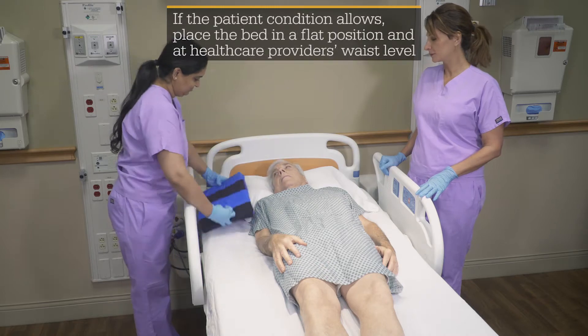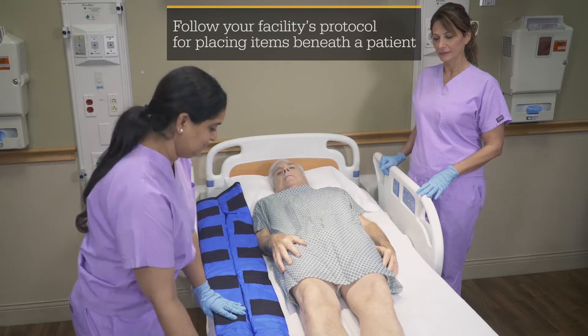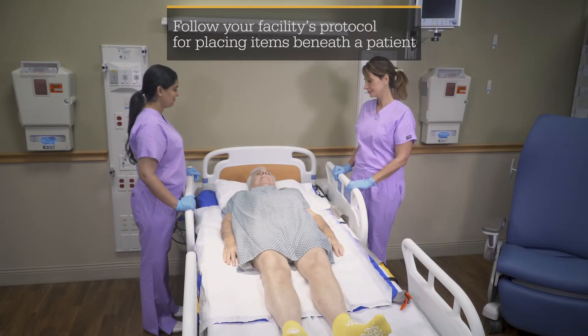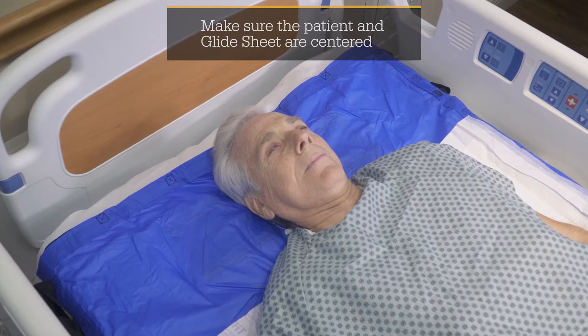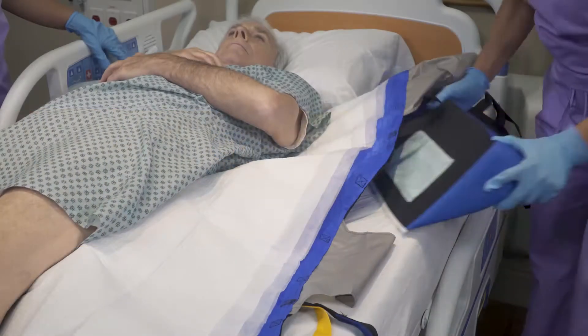Place the glide sheet alongside the patient and unfold with the head indicator toward the head of the bed. Align the upper edge of the glide sheet with the top of the patient's head. Place the glide sheet under the patient according to your facility's protocol.